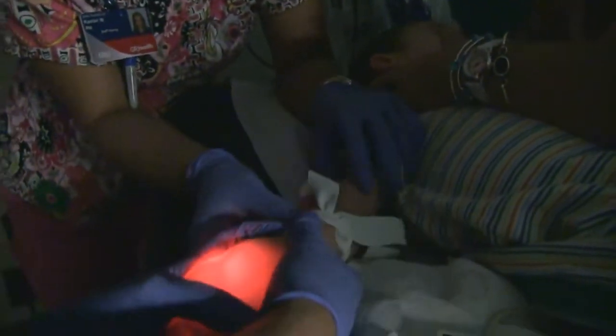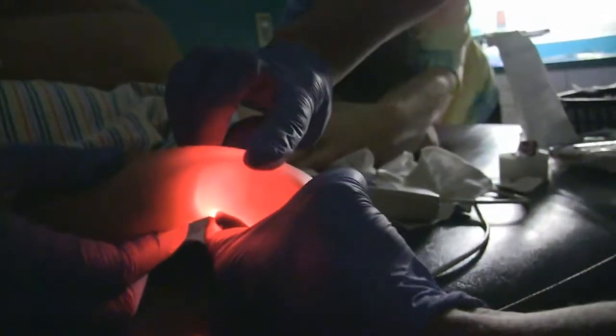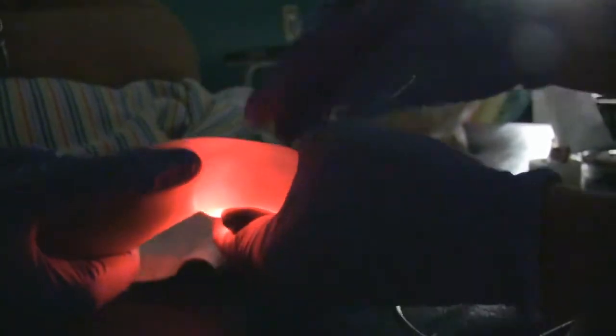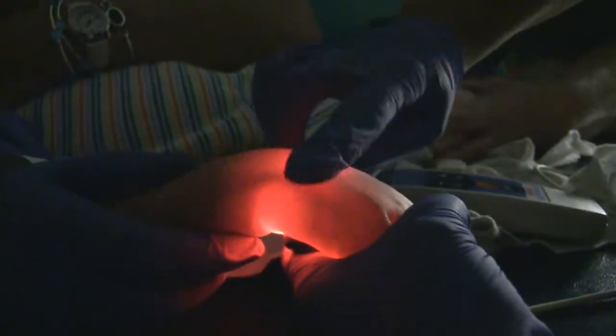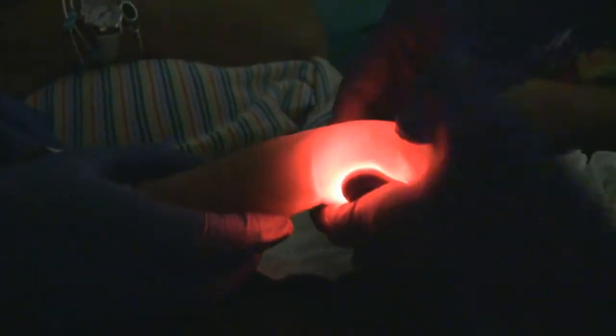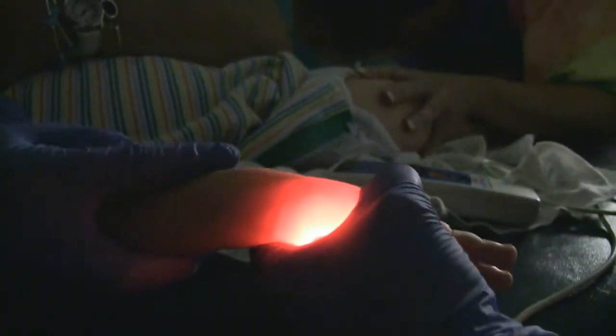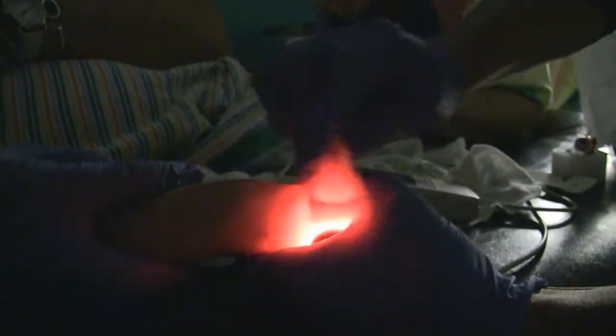I actually kind of like the one over here. This one almost looks like it might be blown or something. I like where this other one is a little bit better, but the fact that it's kind of swollen right there makes me wonder if someone has tried it before. This tool is called a trans-illuminator.